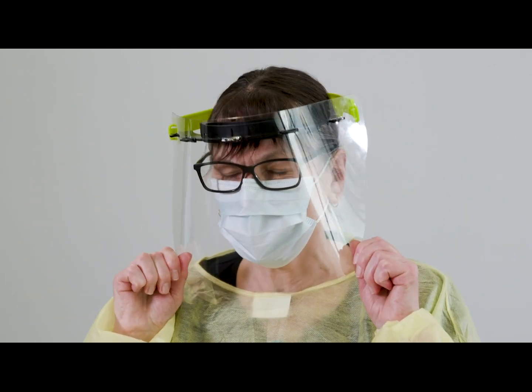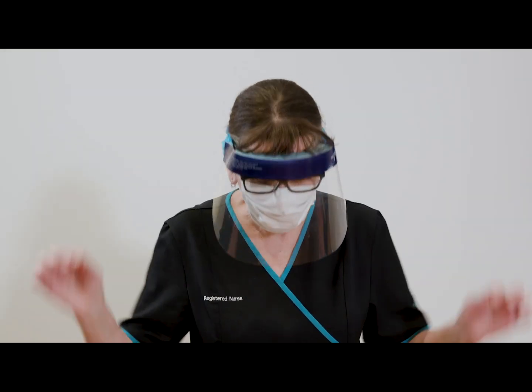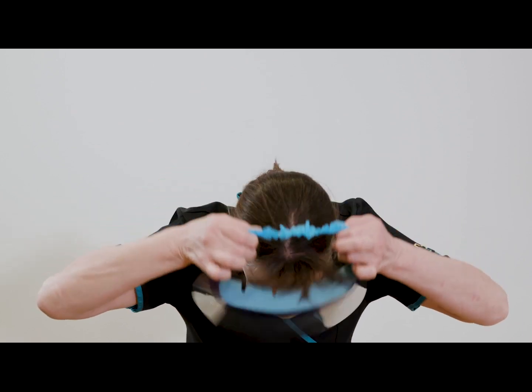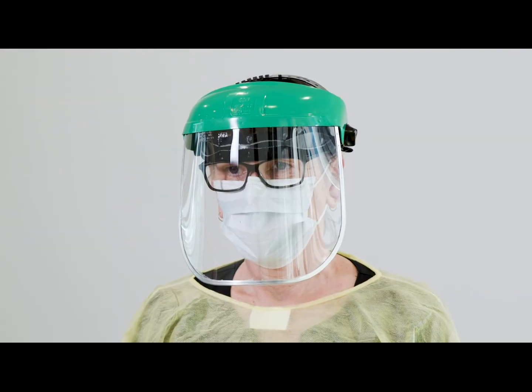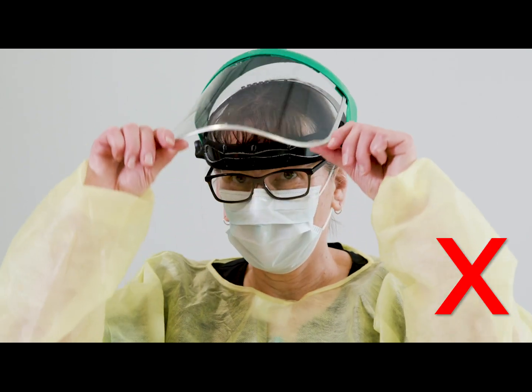When removing PPE, ensure your shield is removed last. Tilt your head slightly forward, undo the straps or take the straps at the temple and pull forward over your head. Then hygiene your hands. Even if the face shield has an option to be pushed into the up position, it should not be. When removing the face shield, do not touch the front of the face shield and avoid touching your clothes or uniform with the lower edge of the shield.